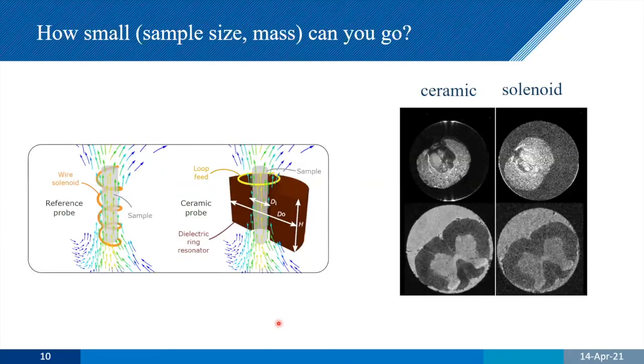As we're building these coils, we realize it's quite difficult to build everything at this very small scale. You have to be very, very careful about how you're winding the solenoids. You've got susceptibility issues. And so this also forced us to look a little bit into different kinds of probes. One of the common themes that's going to come through here is dielectric materials or ceramics.